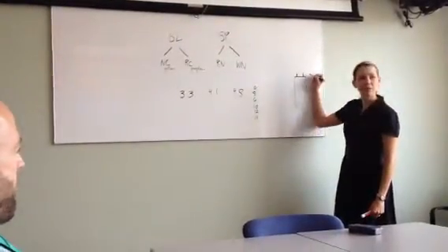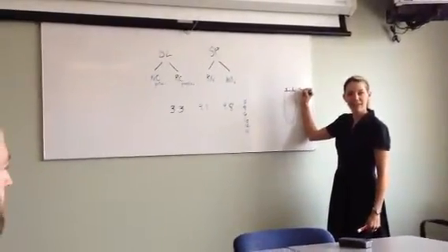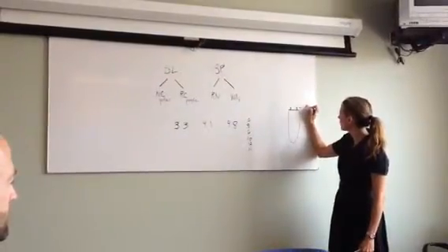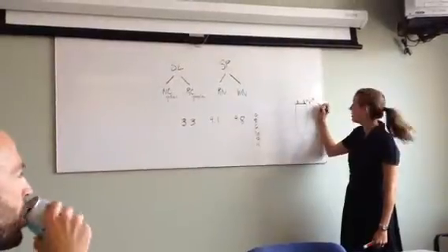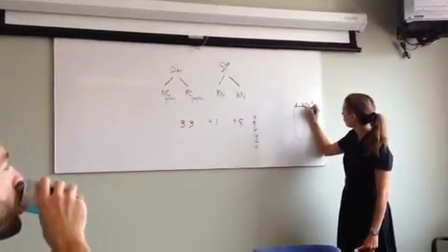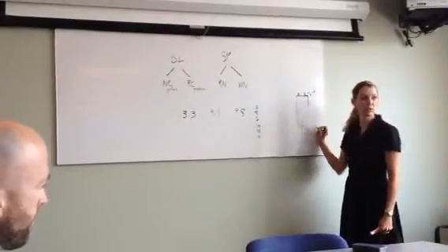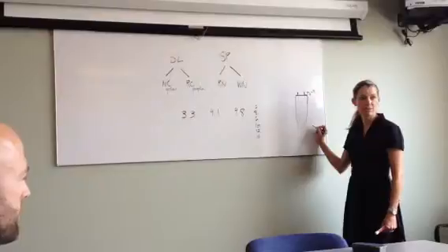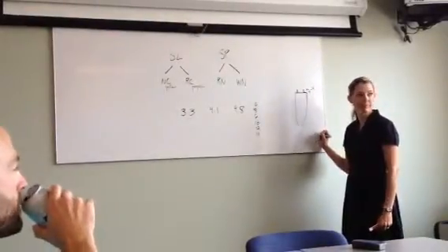Does anyone remember what the offset is? You don't have to know it. It's 0.4 millimeters horizontal and 0.4 millimeters vertical. So Straumann actually has a little bevel here. So you have a vertical and a horizontal offset with a platform switched implant with Straumann. Why is that important?